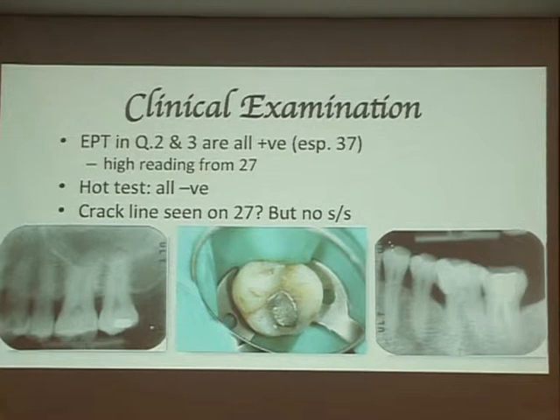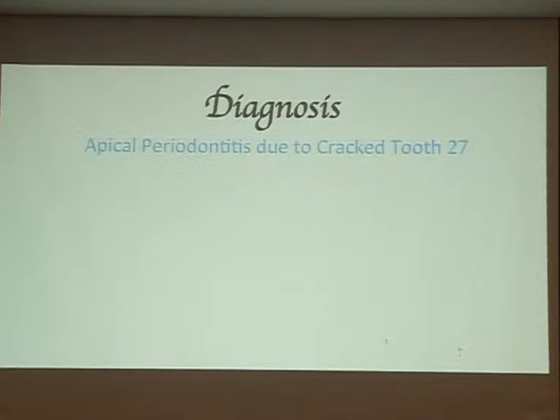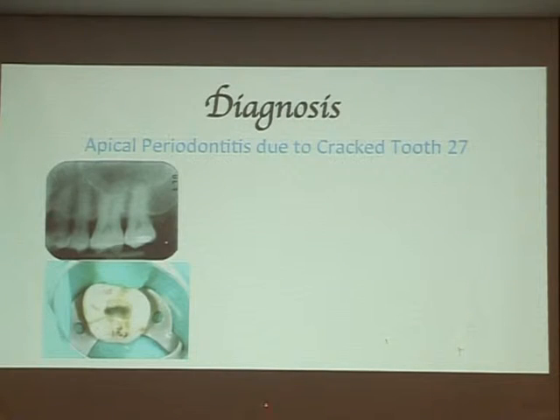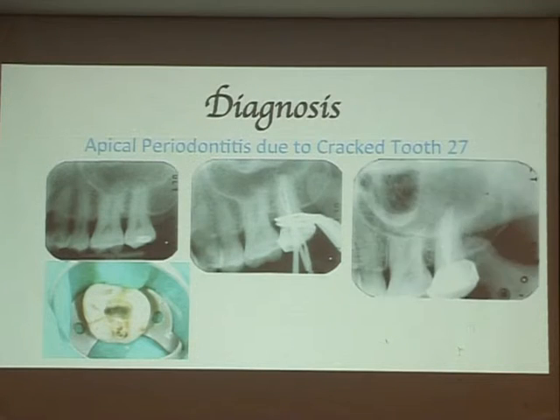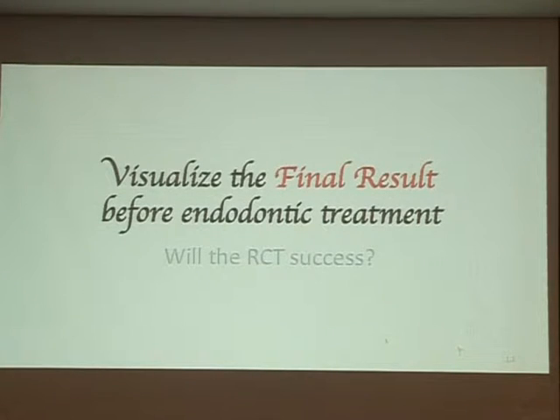So I say, what I'm going to do: I give injections, I remove the amalgam, I check for cracks under the fillings. So, this is my diagnosis. So I open up, I can see cracks, I can see necrotic pulp, so I know I'm in the correct entry to this endo. So the endo was finished, and the patient has no pain.